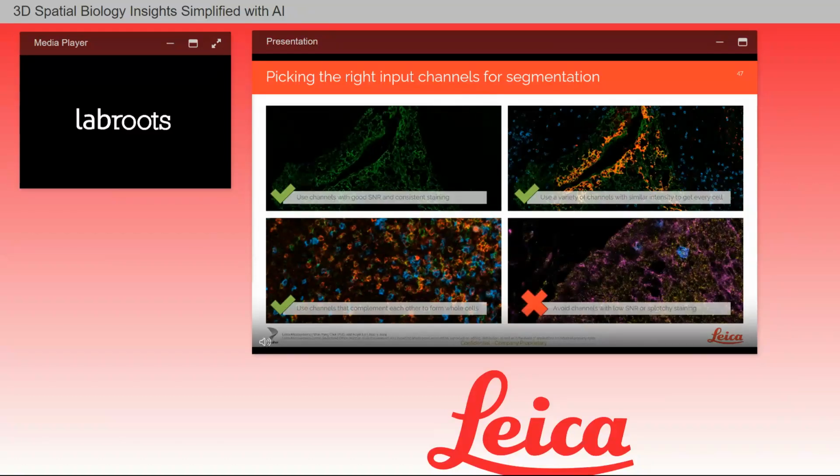And finally, avoid channels that are noisy or with low SNR or with splotchy staining. On this image, the yellow channel looks very speckled, and it is difficult to discern the shape of the cell, while the magenta channel has a lot of breaks in the signal. Both issues may be addressed by first using the pixel classifier to enhance the image, then using the pixel classifier result as input to the multiplex cell detection recipe.